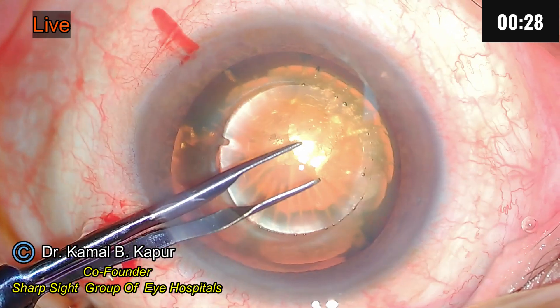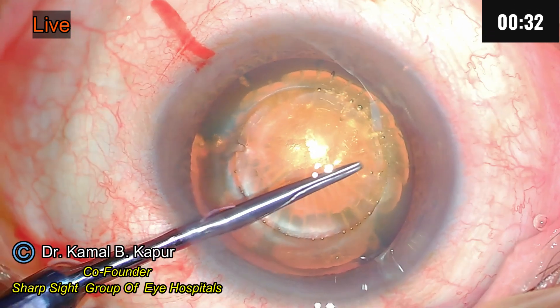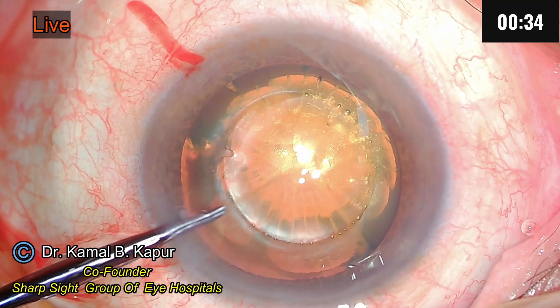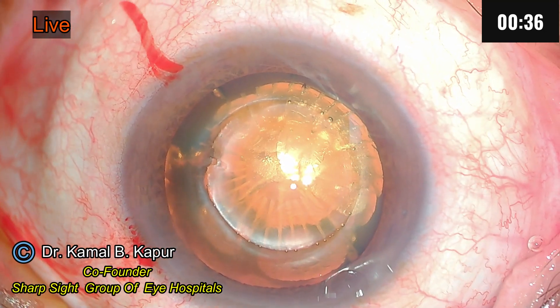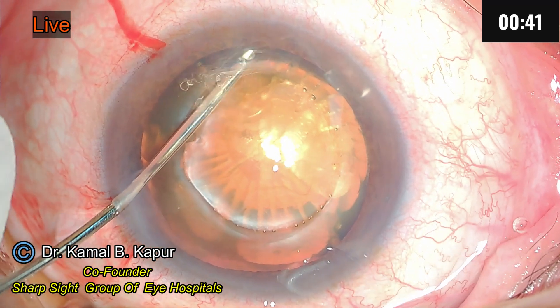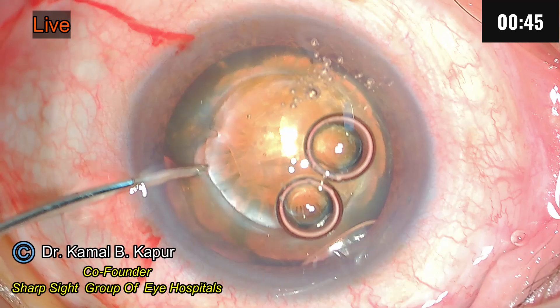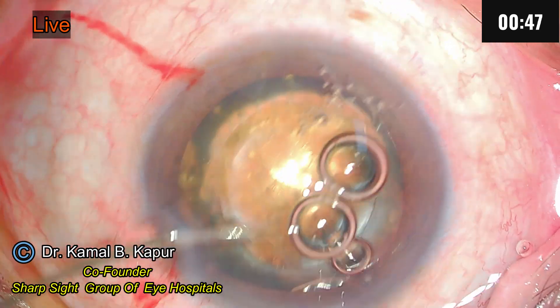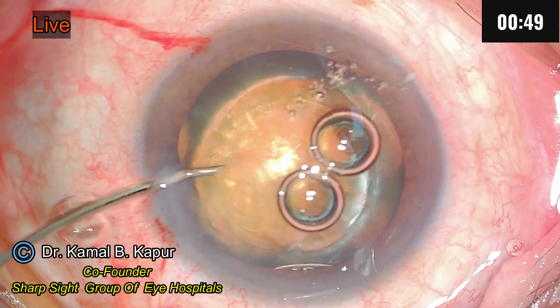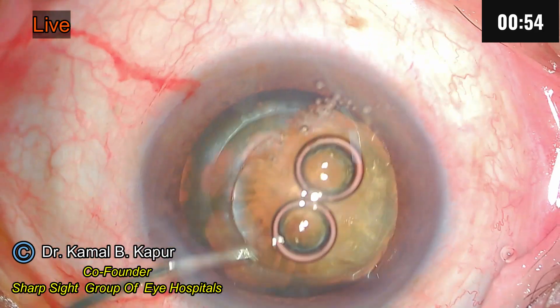Now we will go in, pinch the capsular hexis, make sure it's broken from all the sides, and pull it out. Now this is going to take slightly longer than a normal cataract surgery by FLACS. Next I try and do a hydrodissection. Make sure you remove some air bubbles which have been collected behind the nucleus — this will facilitate the rotation of the nucleus.